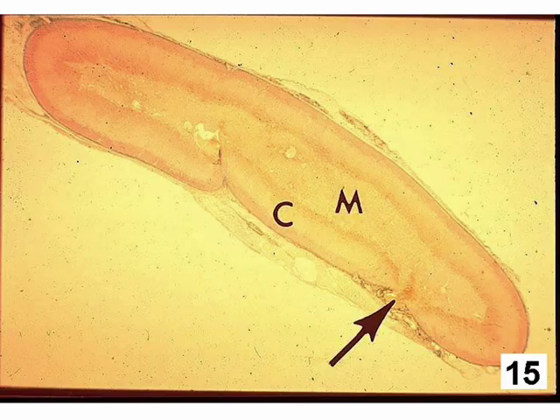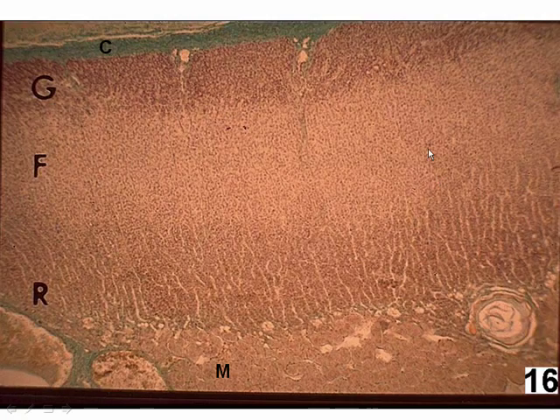At higher magnification, we can see these two different parts of the adrenal gland with greater clarity. The C on the outside here, the outermost layer, is the capsule. This is connective tissue. Note that there are blood vessels just beneath the capsule. And then beneath the capsule is the first layer of the cortex, which is called the zona glomerulosa, and that has to do with the appearance of the epithelial-like cells that exist in this outermost portion of the cortex.